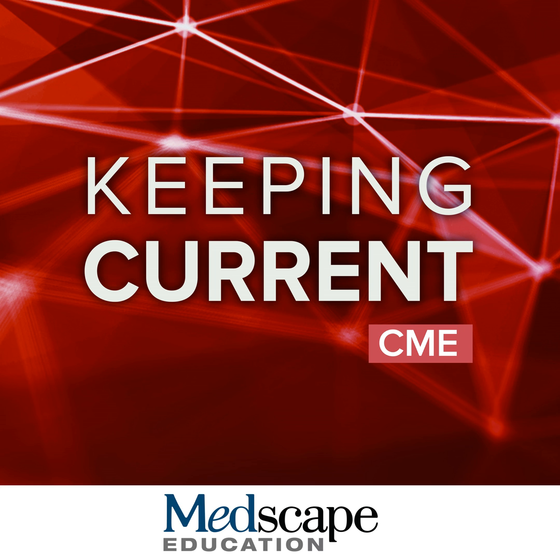In today's talk, I'm going to cover four distinct areas. First of all, I will give an overview of cardiac MRI techniques, and then I'll go into a little bit more detail on the techniques used for late gadolinium enhancement. I will try to illustrate some of these techniques with clinical examples, and finally, I'm going to finish up with a few artifacts that we encounter and how we try to deal with those.